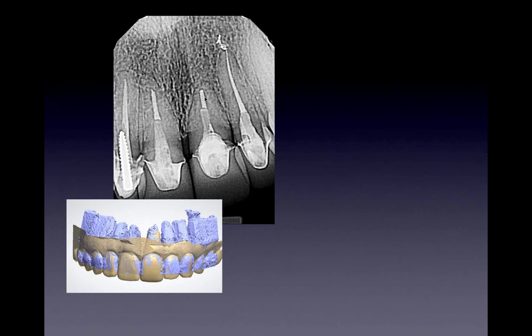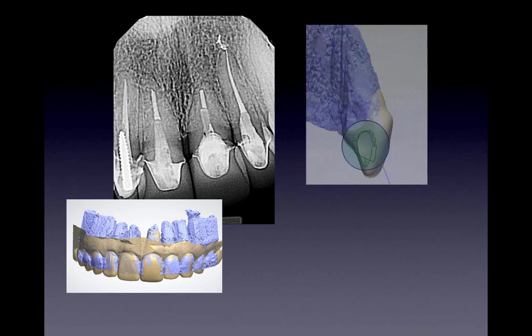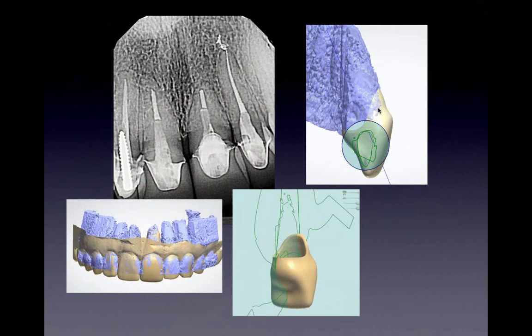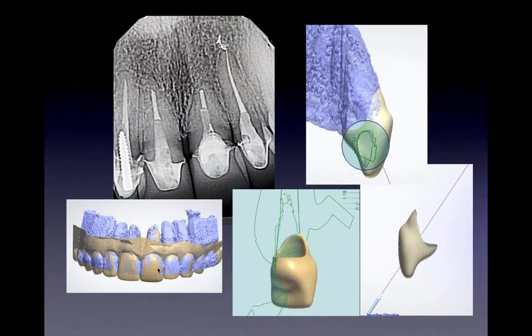And rule number three is you have a good internal connection that you can screw into and that your screw's not going to get loose because you can't get it out after the implants. And you've got to wait at least 3 months before you touch it. So here we're using digital design. If you young dentists out there are doing scanning with scanners, this is a Trio scan of the tooth. We're making a provisional with the laboratory, so he's fabricating us a provisional based on the CT scan and based on the scan of the original tooth.